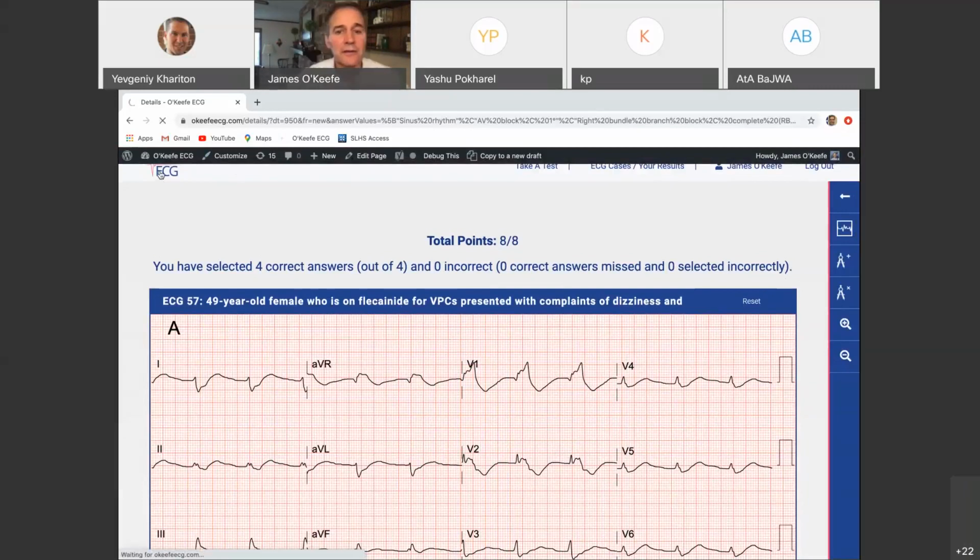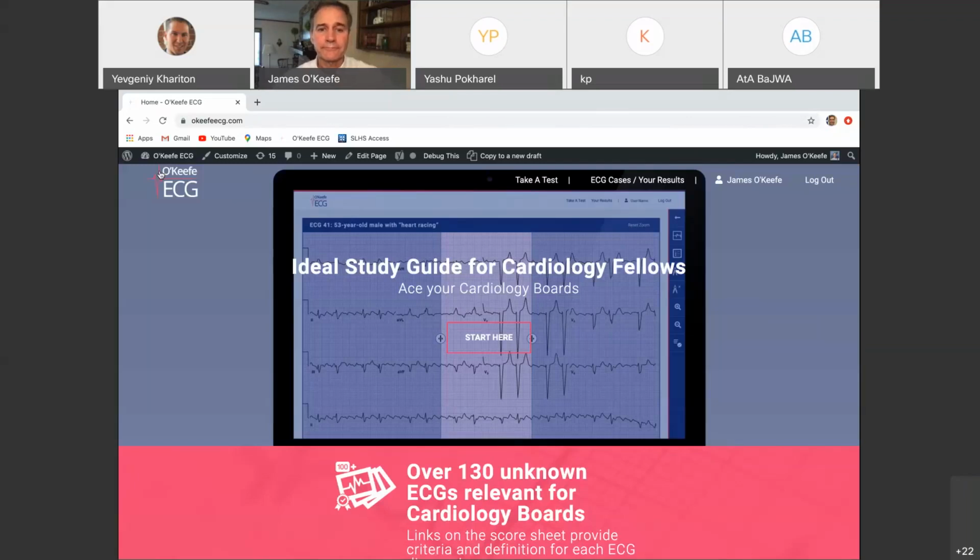So for the prolonged QRS, that's only represented by the right bundle? Say again. Basically prolonged QRS is the hallmark of flecainide toxicity, and for coding purposes, that's only represented by the right bundle, right? No, I mean, the left posterior fascicular block would also be just due to general poisoning of the myocardium and the conduction system, so those are secondary to that. And like I say, all that stuff went away when the flecainide level drifted back down towards normal.